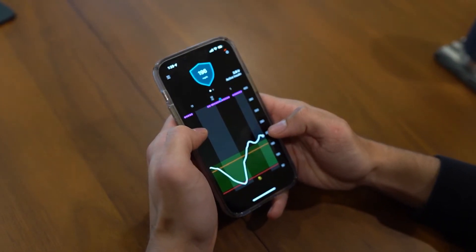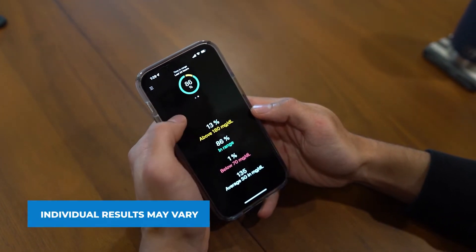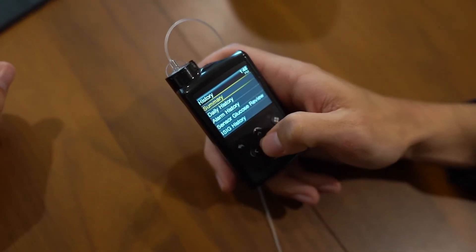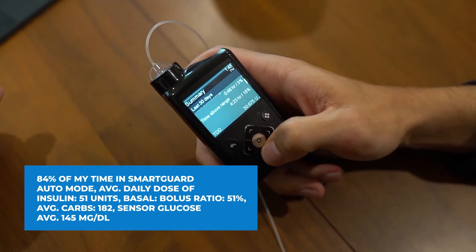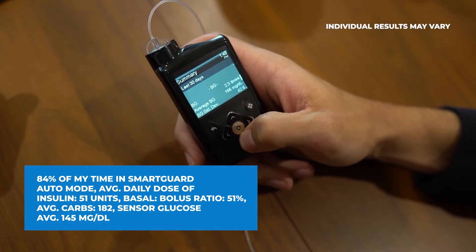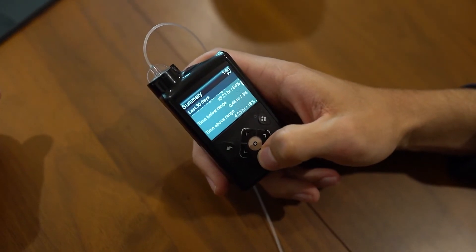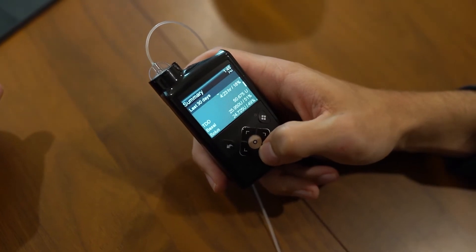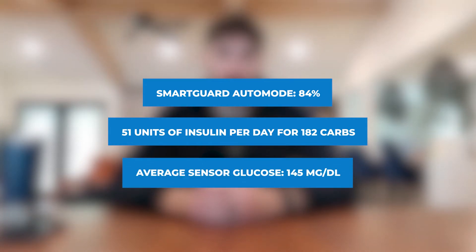These are my metrics for the last 30 days. Time in range metrics obviously vary over a 30-day period depending on my daily time in range and things that may have impacted my glucose. There's still some room for improvement on the high side, but I'm happy with my results. Going back to the history screen and selecting Summary, over the past 30 days I've spent 84% of my time in SmartGuard auto mode, with an average daily dose of insulin of 51 units, basal-bolus ratio at exactly 51%, average carbs 182, and sensor glucose average of 145 milligrams per deciliter. I'm actually most surprised by my basal-bolus ratio being 51 to 49 — that was a big learning curve when I started on the MiniMed 670G system four years ago. Overall, I take 51 units of insulin per day for about 182 carbs with an average sensor glucose of 145 milligrams per deciliter. Not bad.